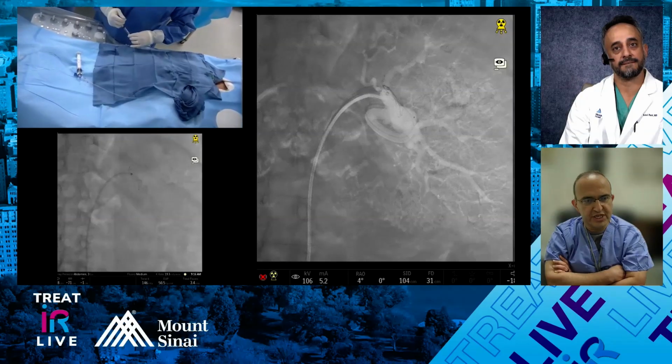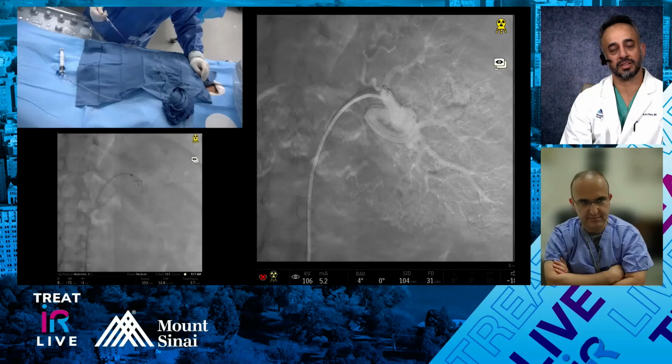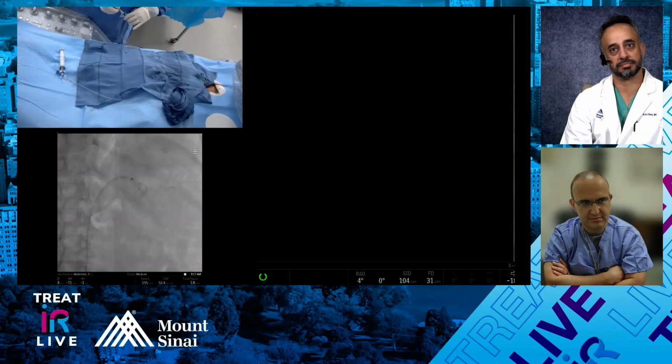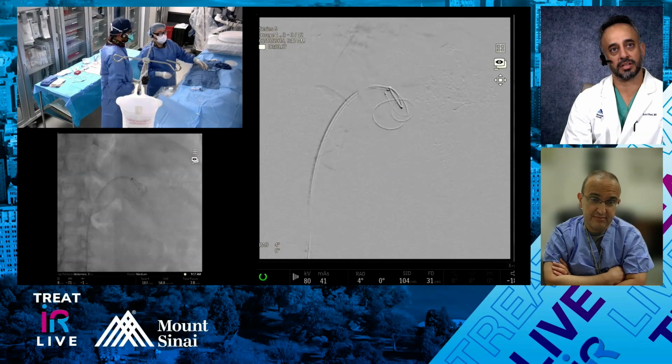While we're chatting, just for fun, we decided to go into the outflow vessel. But again, I'll leave it up to discussion. Do I need to go into the outflow vessel here? Are we sufficient with just coiling the sac, or should we coil back? Historically, people will say, "Oh, well, you need to get the outflow vessel."